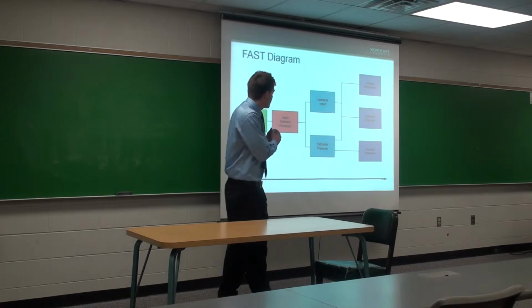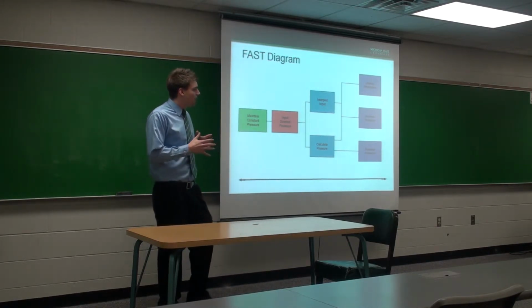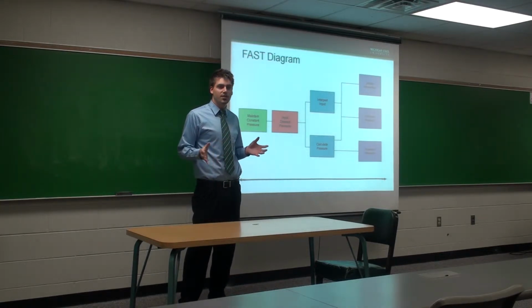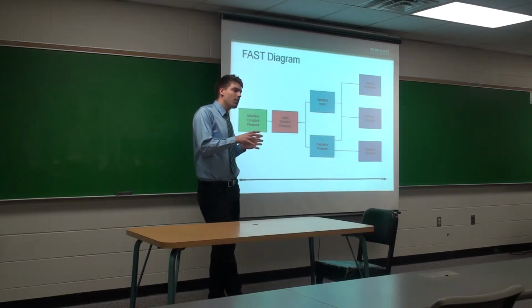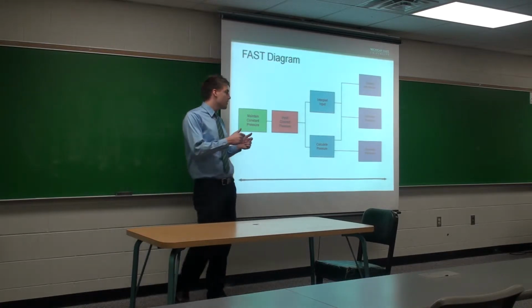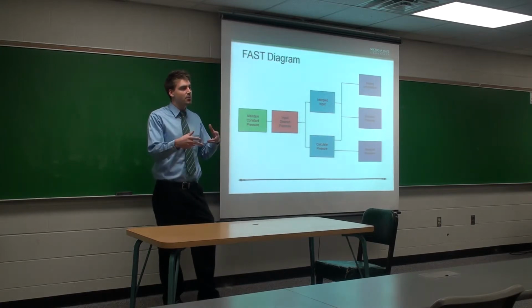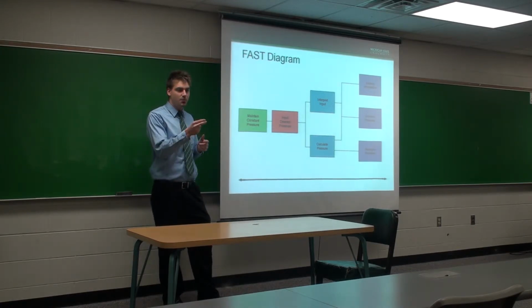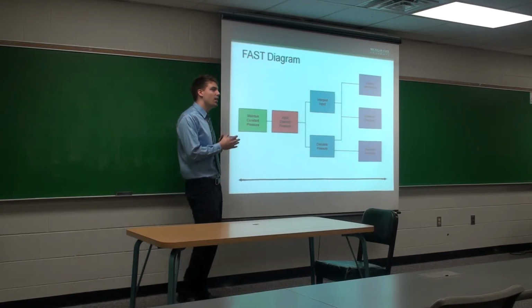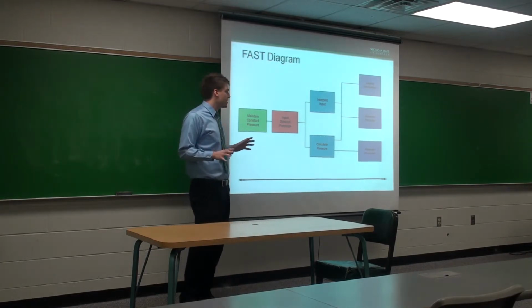This is our FAST diagram, just outlining the things that we hope to accomplish with our device. Essentially, we would like a device that can receive an input pressure, a desired pressure value, and hold the pressurized balloon at that pressure using a feedback sensor. The microcontroller in our device would directly operate a stepper motor, which will simply push in or pull out the syringe, effectively increasing or decreasing the pressure of the test. Again, we'd like to automate this test and get rid of all human error as much as possible.